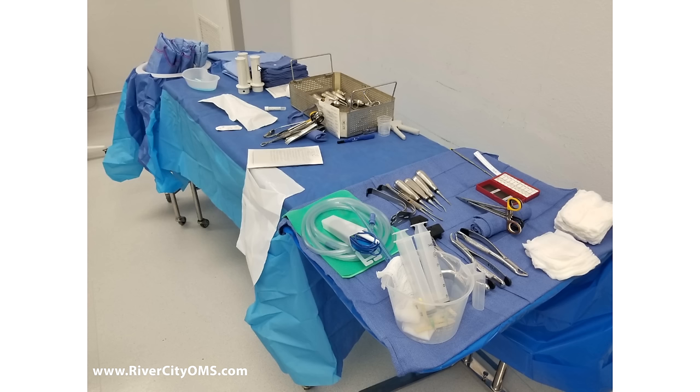These are sterile light handles that go on the lights so that we can grab the handle and move the light around without contaminating our gloves. That's called an emesis basin, or a lot of times we call it a kidney basin because it looks like a kidney. You can see there's the toothbrush in there and then the green mouthwash. This is what I use to clean the patient's teeth before we really get going in the surgery. Some sterile towels. Back here are some sterile drapes. Over here are the sterile gowns that we're going to put on. Now, that's not on the back table. That's in a separate little cart that you can see here. But those are sterile gowns to be worn, for me and the assistants.